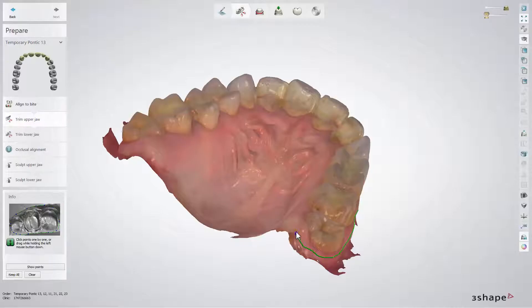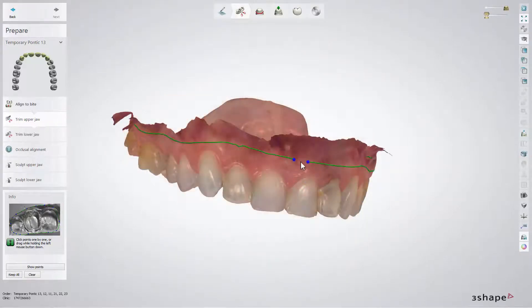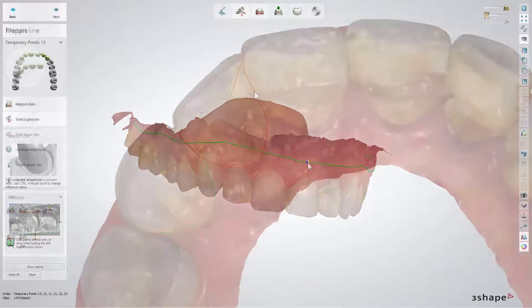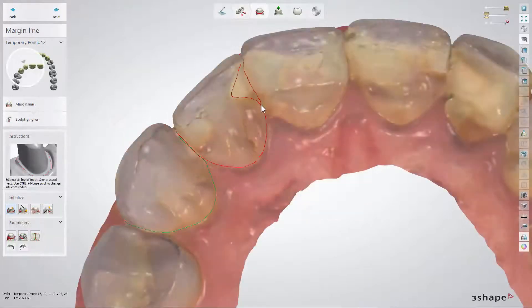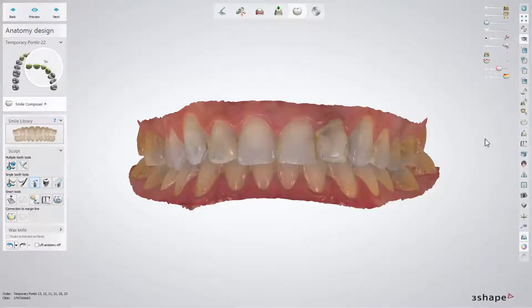Now go through all the design steps. While in the Anatomy Design Smile Composer, enable the RealView engine.